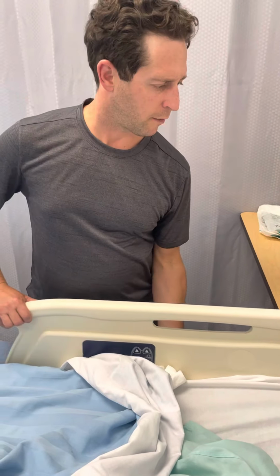Pat, I've looked for safety equipment, oxygen and suction, clamps, and Jelonet gauze, and petroleum impregnated dressing. So I'm just going to make sure the bed is at a comfortable height.